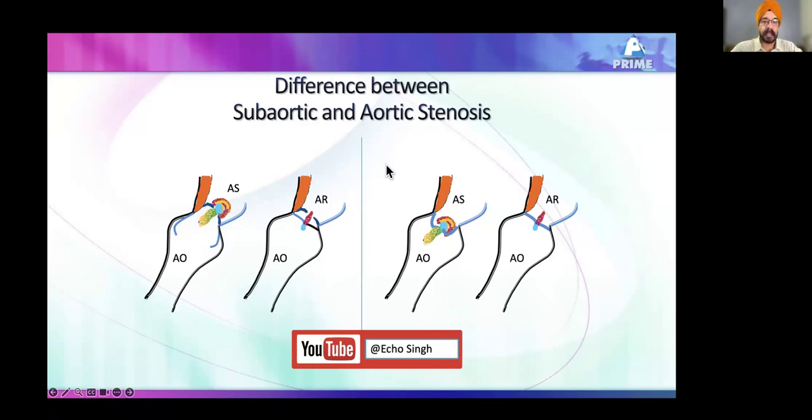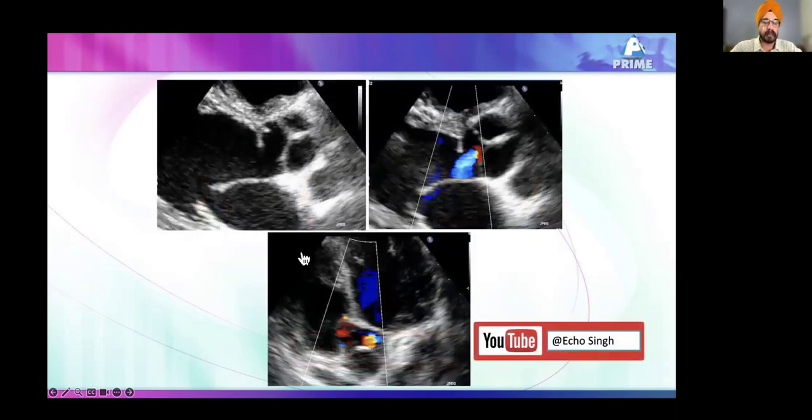This kind of discordance can help you to make an assessment of a subaortic stenosis where the membrane may not be very clearly visualized. I am going to take you from case to case, about 5 or 6 cases, where the subaortic membrane was very clearly seen and where the subaortic membrane was not visualized. And this Doppler formula or trick helped us make a diagnosis.